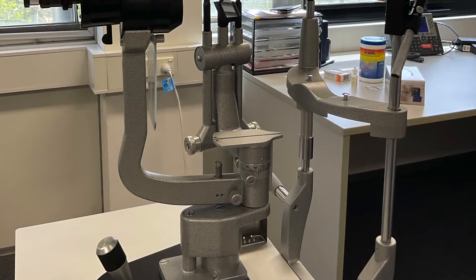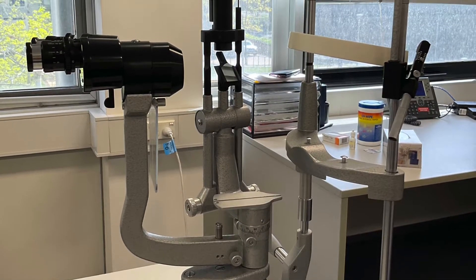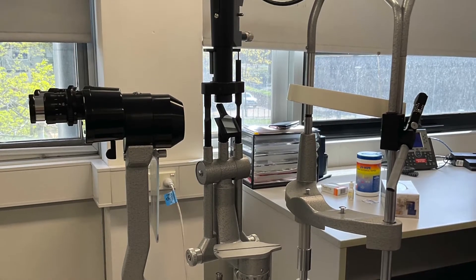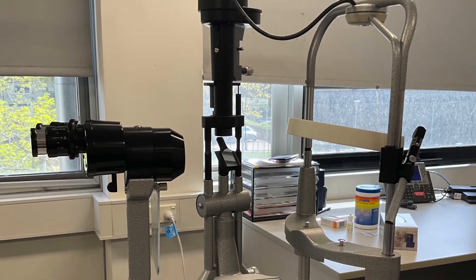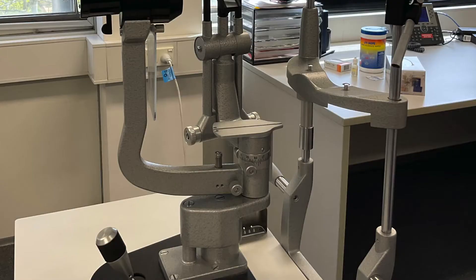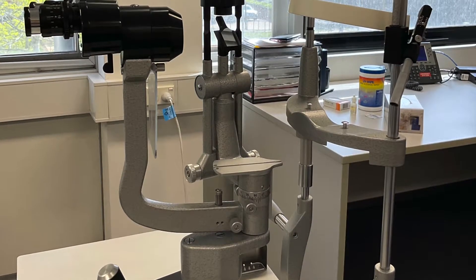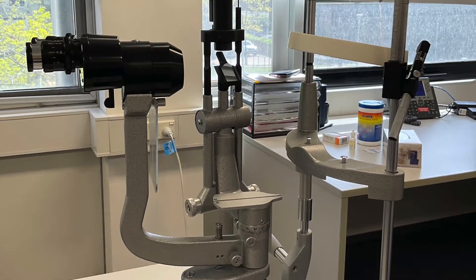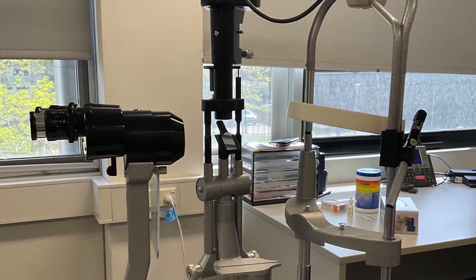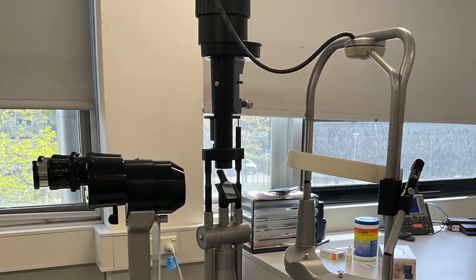Though there are many instruments available for measuring the pressure of the eyes, such as the Perkins tonometer, the Tonopen, and eye care, today we'll be using the Goldmann Applanation Tonometer. The Goldmann Applanation is an instrument which takes the pressure of the eyes by measuring the force required to flatten a known area of the cornea. It is also considered an industry standard and appreciated for its accuracy, reliability, and reproducible pressure readings.